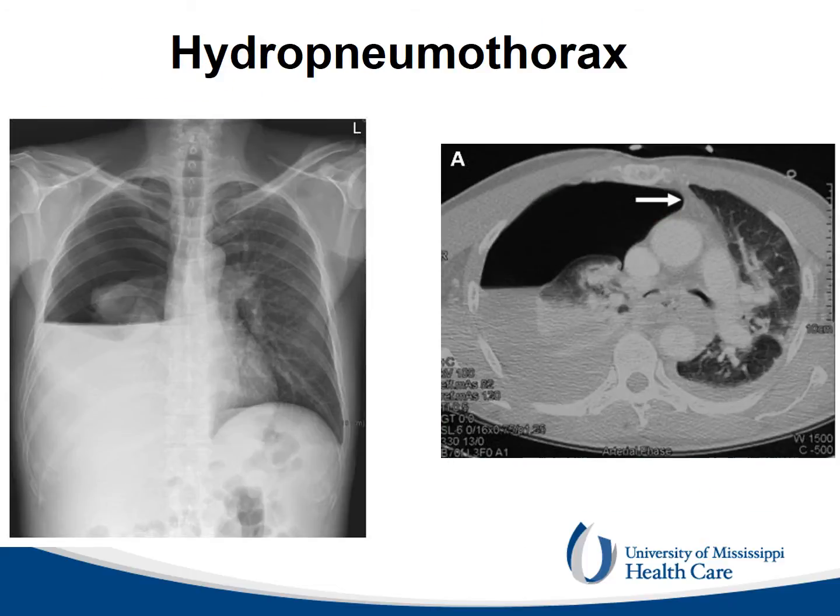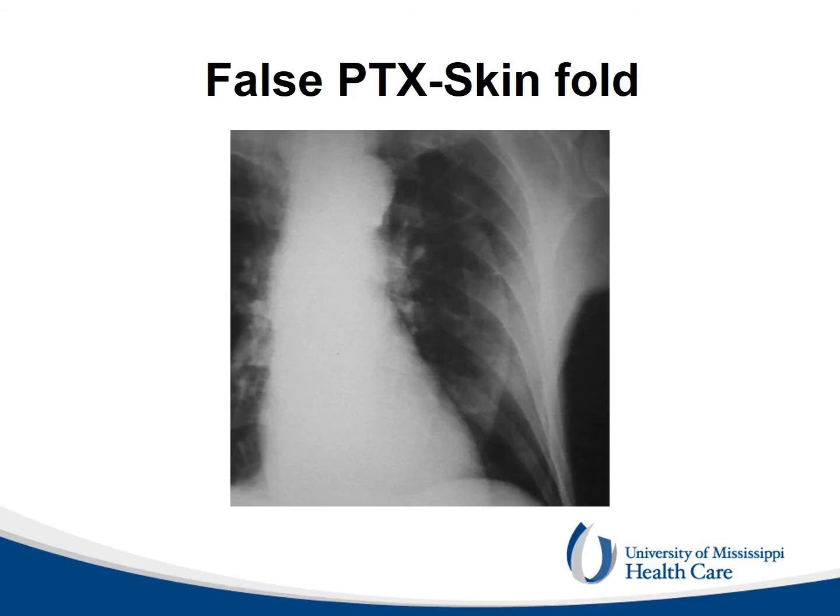The term hydropneumothorax implies the presence of air and fluid level in the pleural space. The chest X-ray and chest CT in this patient show a straight line that changes with different decubitus. Sometimes a wrong diagnosis of pneumothorax is made on a chest X-ray for different non-related conditions. Skin folds that overlap the lung field can be misinterpreted as pneumothorax on a chest X-ray. A chest CT would clarify the diagnosis.